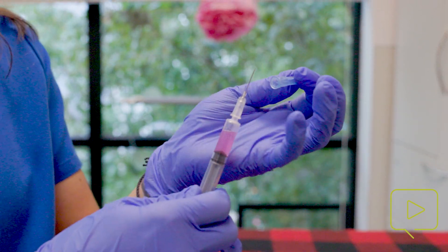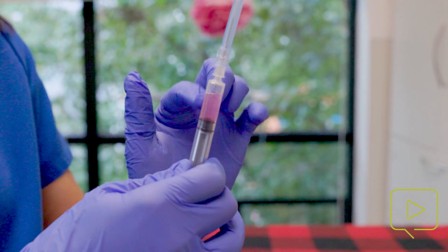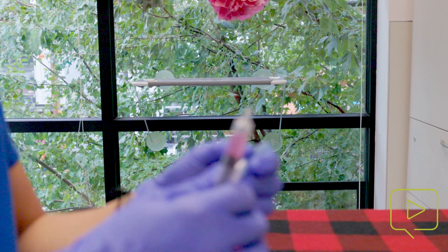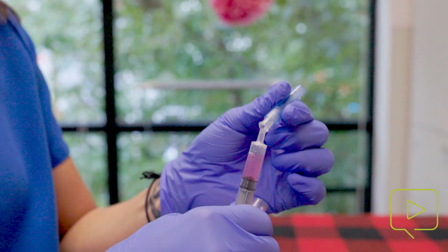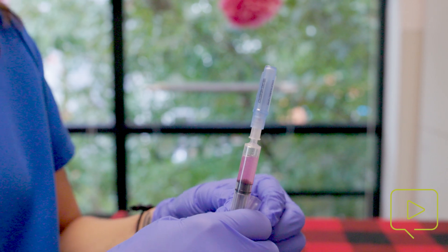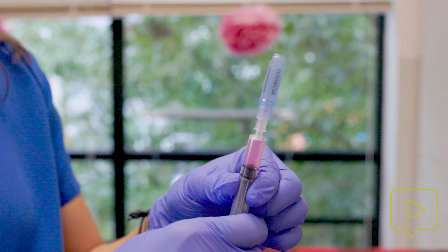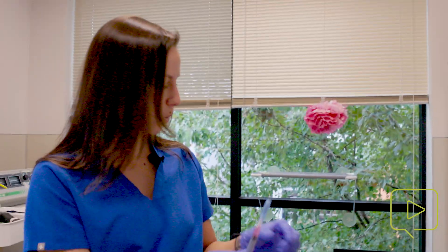We don't have any bubbles in this one, but I like to make sure there are no bubbles trapped, and I lower in my vaccination. It's really important that we also change our needle before administering to our patients so we have a fresh needle and we're not trying to poke through skin with a dull needle. Then again, getting rid of all the excess air — and we are ready.